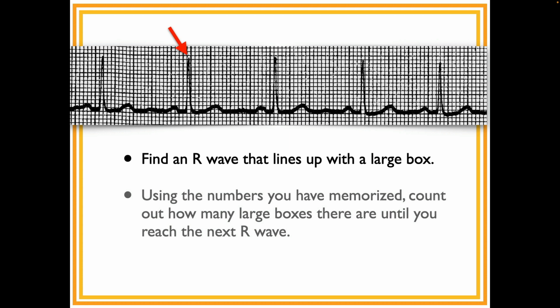So here's 300, 150, 100. Oh, this is going to be really similar to the other one. 75, 60. So we know that our rate lies somewhere between 75 and 60, and what's it closer to? 75. So what do we think would be a reasonable number? 70. Yeah, 70. So I think that's pretty good. Okay.